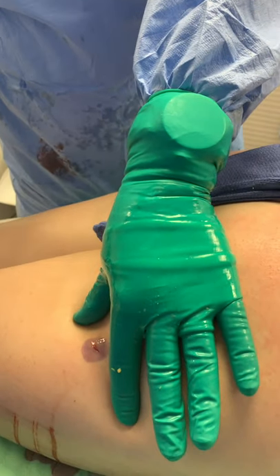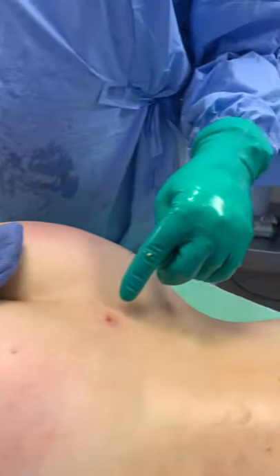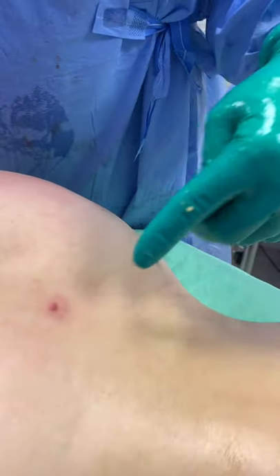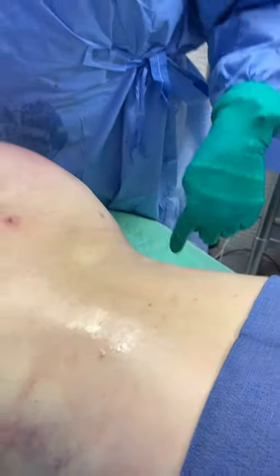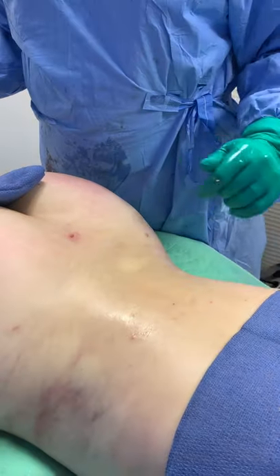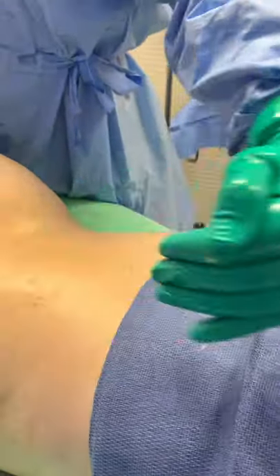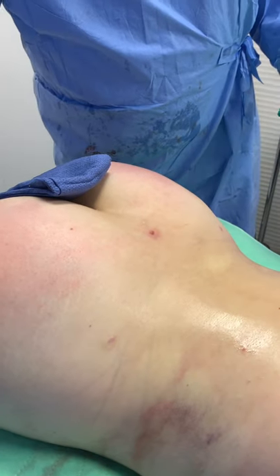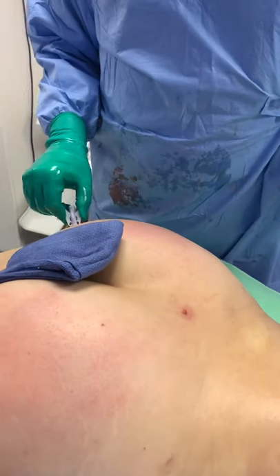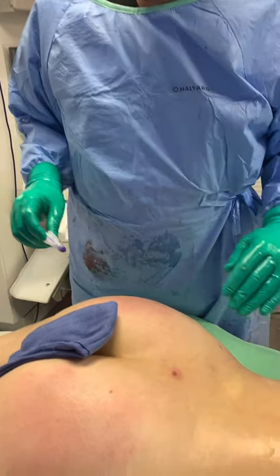And then the other ones I like to sew up. I put one single suture between, like this one right here, this tiny little hole. This is the only hole on her for her flanks. One single hole, I sculpted all of this, snatched her waist. She has one there, one on each shoulder, and I come down and do that part as well. But you don't have to put a bunch of holes all over people to accomplish what we've accomplished here.